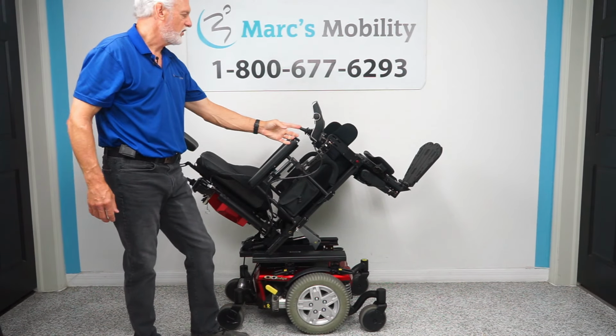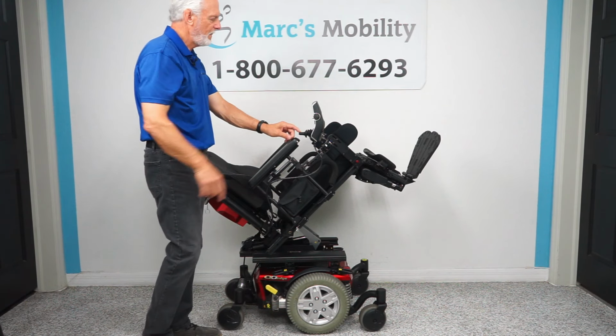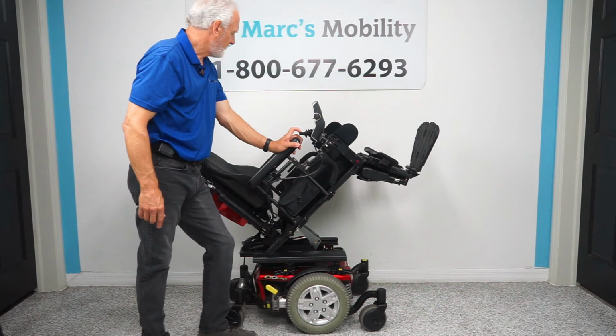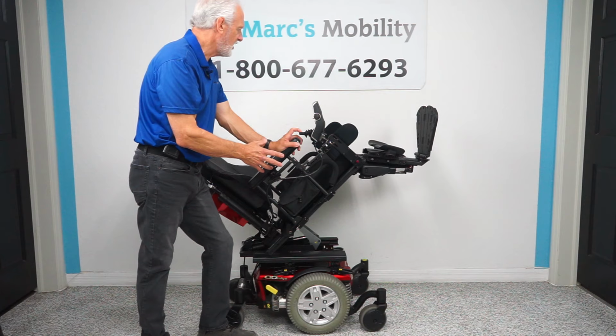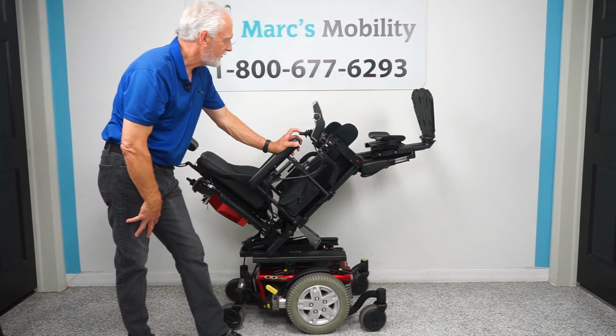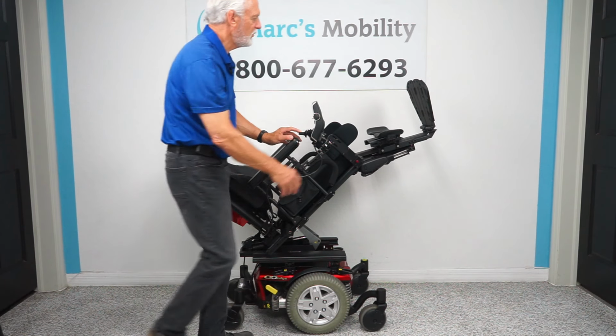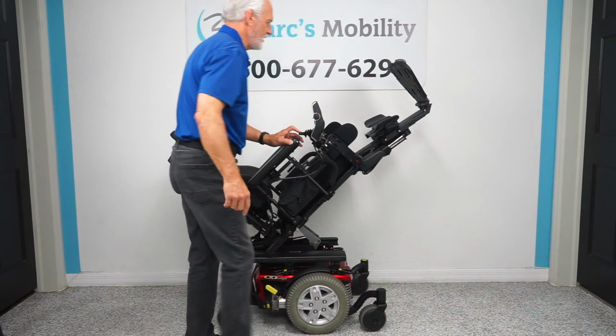The next thing I'm going to show you are the feet. So the feet, so now I've got the legs yellow. So the feet are adjustable. So on this chair right here, we're not going to really change the seat because the seat's big enough already, but we can adjust the legs. So if you're tall or short, we can make it whatever length we need. It's all adjustable by moving these 2 screws right here. We can move these legs out or in.